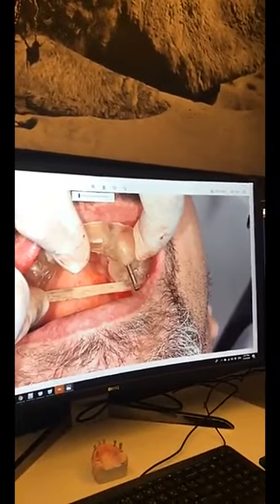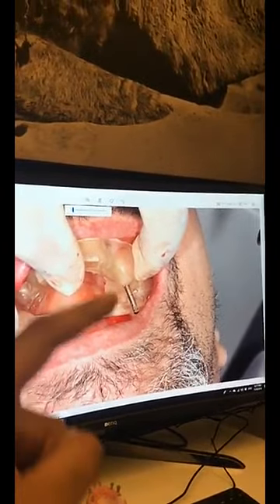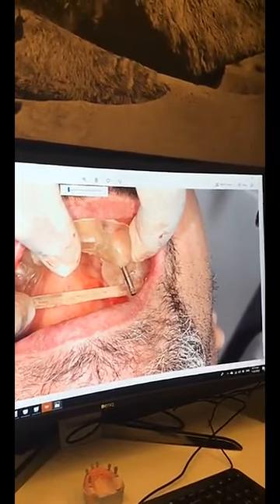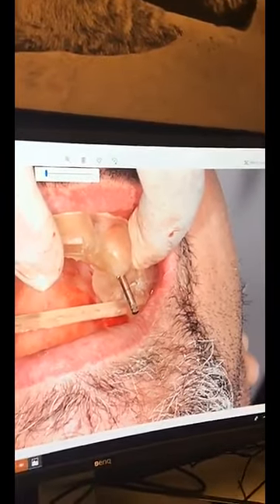So in the surgical theater, as you can see, this is how the pilot drill that is used to do the initial alignment for the implant looks in place surgically through the virtually placed implant.